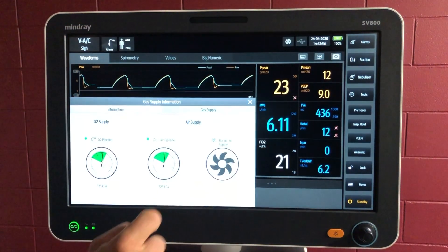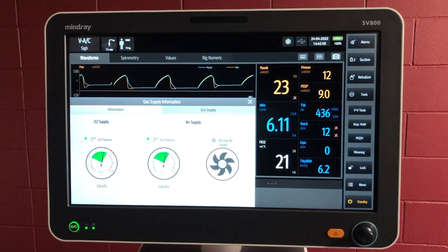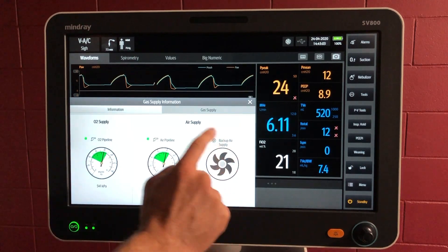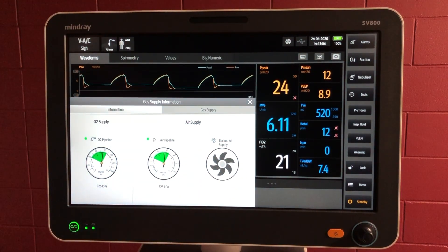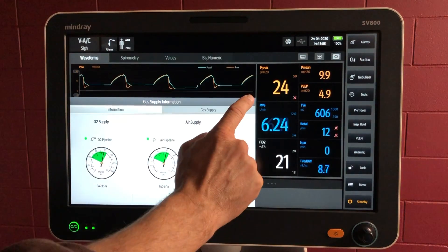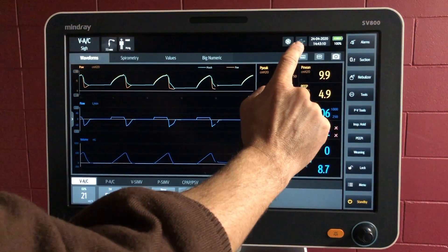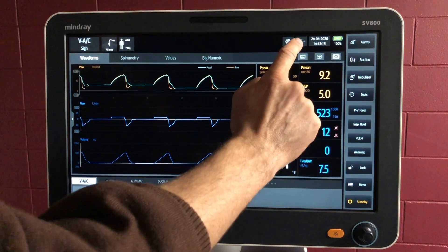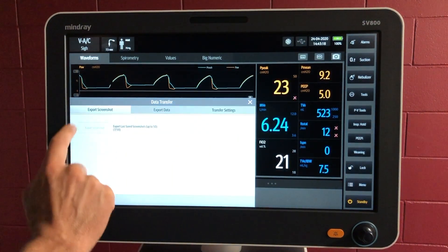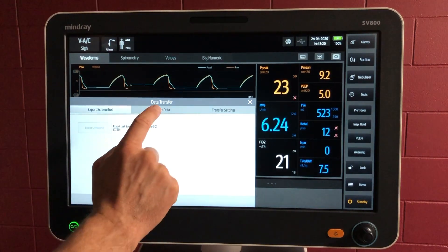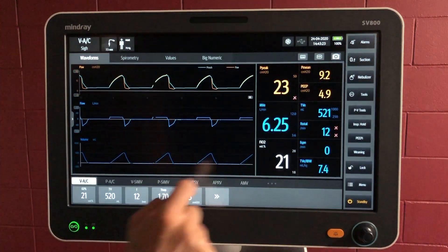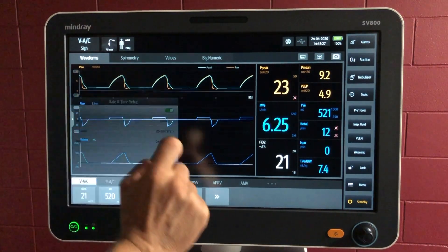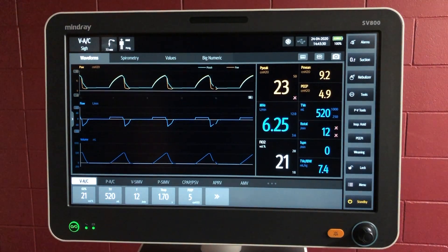Here's the gas supply information. We've got oxygen — good supply. Air — good supply. And if you have a backup supply on the ventilator, for example a little compressor, that will also show there as well. Here's your USB — it's not enabled at the moment as I don't have a USB stick plugged in at the back, but if I did it would show there, and we could export the screenshot we just took or export some data. Here's the time if you need to change anything, and the battery's sitting at 100%, which is great.